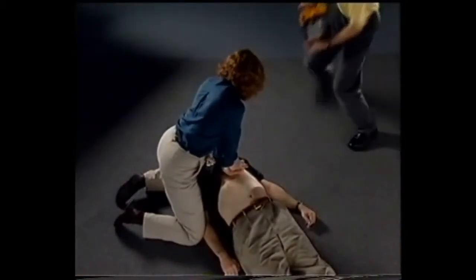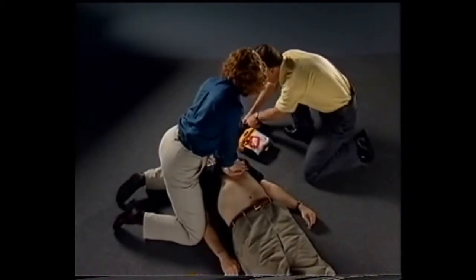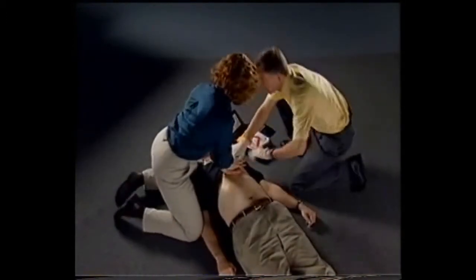Place the defibrillator by the patient's head. Press this button to open the lid and turn on the defibrillator. The defibrillator prompts, "Call for help now." If you've already called your local emergency number, go to the next step. Remove clothing from chest. Let's get the clothing off.